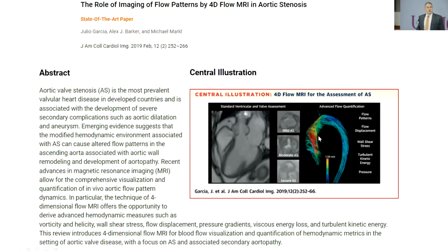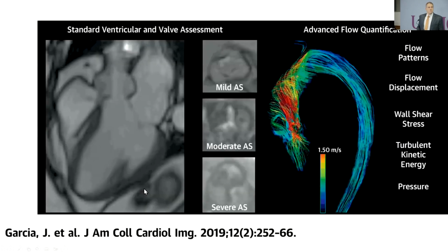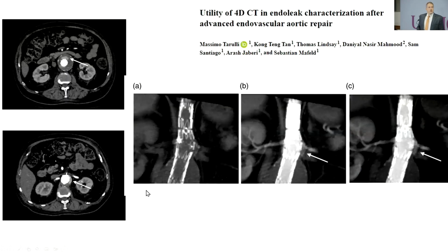And I think another exciting area is 4D flow imaging. As we look at morphology of the aorta, opportunities to look at the flow and how that interacts and affects aortic structure and aortic follow-up is a potential big area. And finally, we can do dynamic imaging within a heartbeat. We can also use dynamic images with multiple phases. So getting at endoleaks may be a way to look at that because, with complicated endografts, it's often hard to tell where endoleaks are coming from.